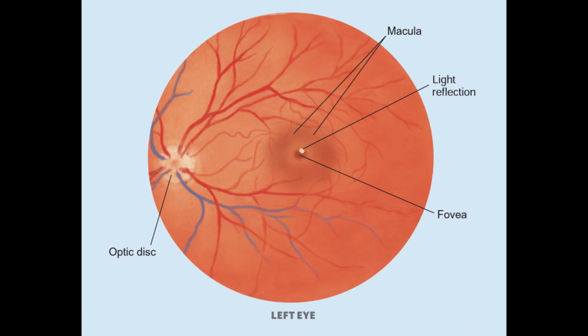As you search the retina, move your head and instrument as a unit, using the patient's pupil as an imaginary fulcrum. At first, you may lose your view of the retina because your light falls out of the pupil. You will improve with practice. Lesions of the retina can be measured in terms of disc diameters from the optic disc.